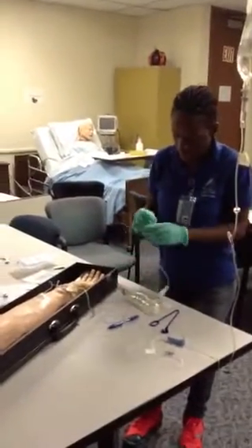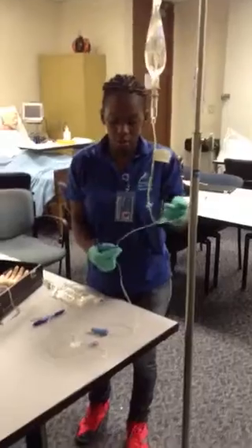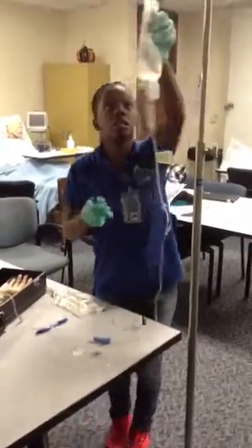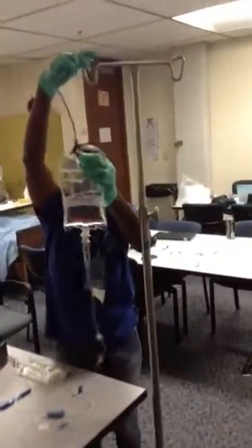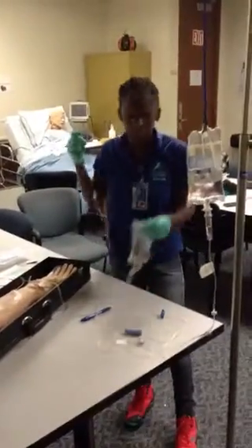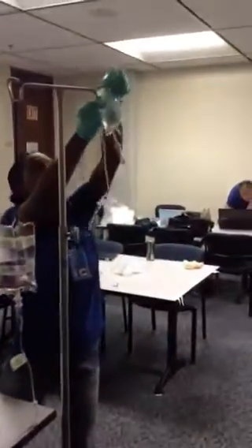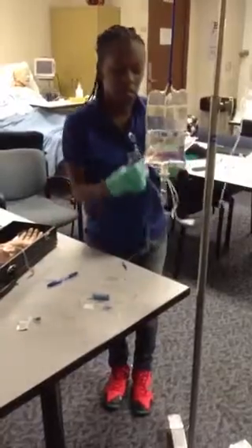I have my bag. Since my clamp is below the port, I make sure it's unclamped, which it is. I'm going to hang this — hang my piggyback bag like that. I'm going to clean off my port, which is the highest port.